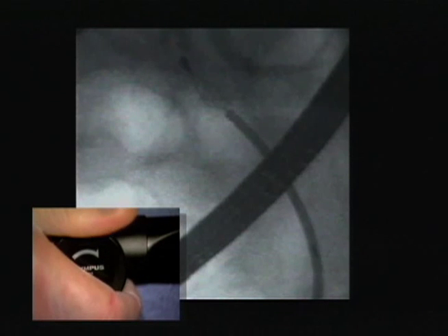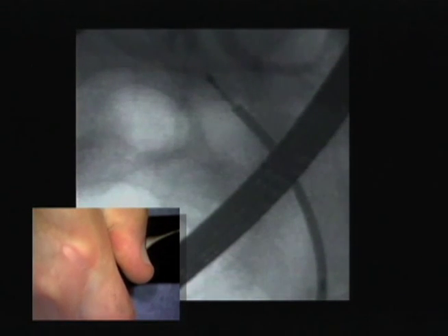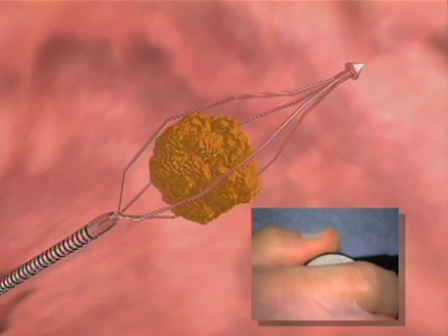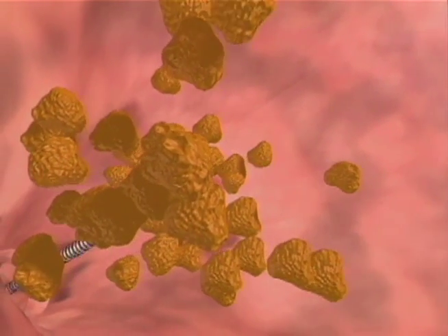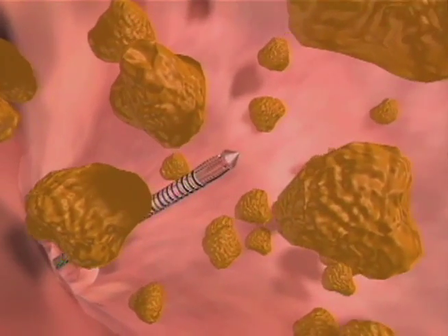While grasping the calculus, turn the rotatable knob of the lithotriptor handle in the direction of the arrow, or in a clockwise movement, and the basket will crush the calculus. Do not rotate the knob vigorously. Once the basket is tightened down on the stone, crushing is best done by turning the knob and holding it for a few seconds, continuing to turn and hold until the stone is crushed.